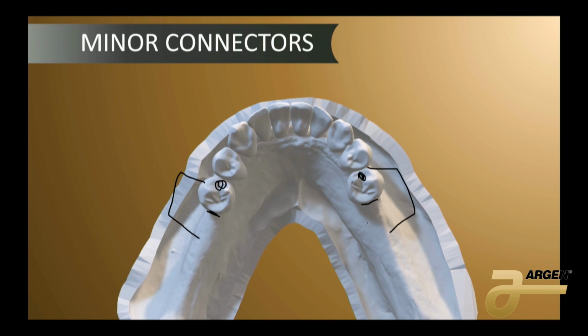And your fulcrum line is not just on one tooth. That can be extended across your whole arch. You need to know where that fulcrum is across your arch because your partial can rotate on that line. So your fulcrum line for your whole arch is a line between your most posterior rests, so right here. That's our fulcrum line. We need to brace against that whole fulcrum line.